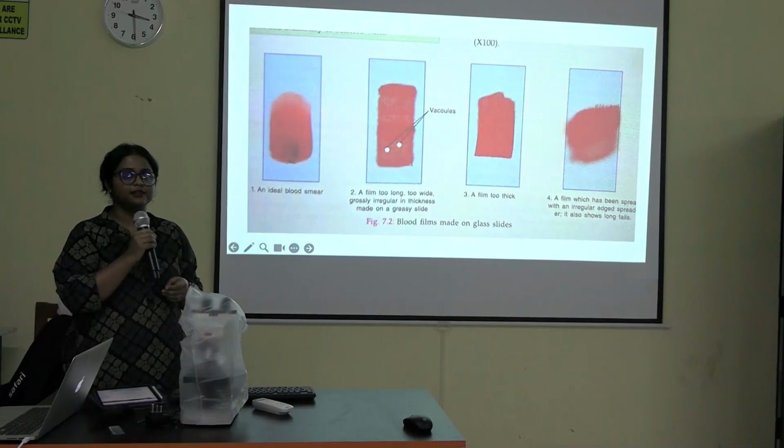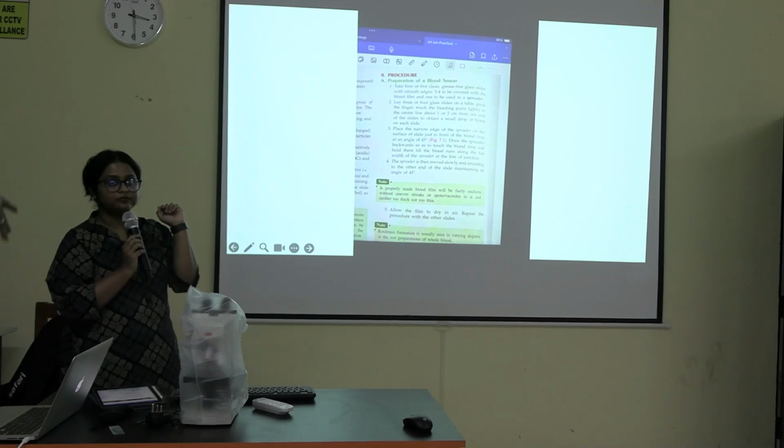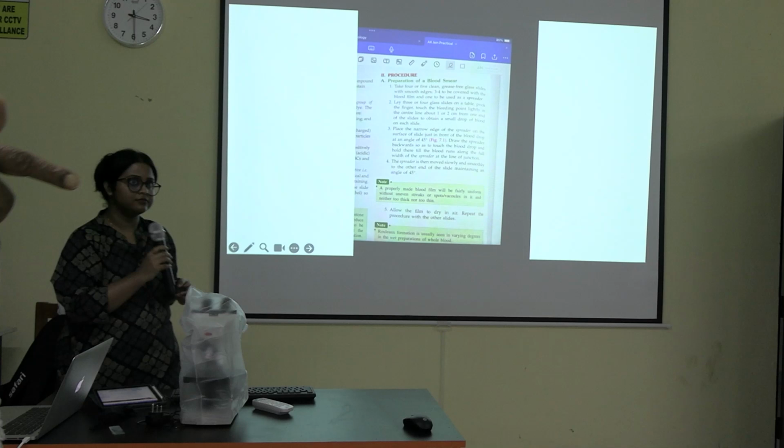Okay, so next is staining. Now we'll start staining the smear. The procedure is written here. Any one of you come and read the procedure once. Yeah, Madhurima, you come.